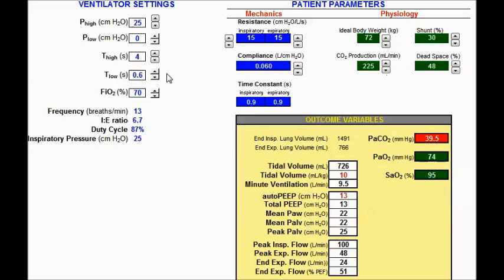T-low is going to vary, and FiO2 will remain constant. On the right-hand portion of the screen we look at patient parameters. For mechanics, resistance is going to remain the same for both inspiratory and expiratory — this is a common resistance in ARDS patients. Compliance will be changing; we are going to be testing three different compliance values: 15, 30, and 60.